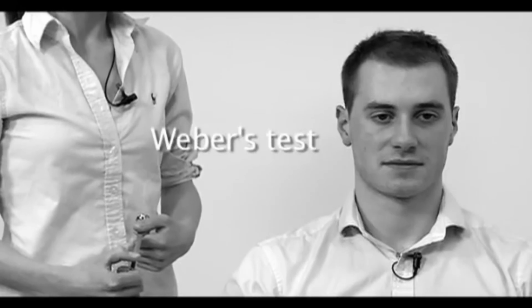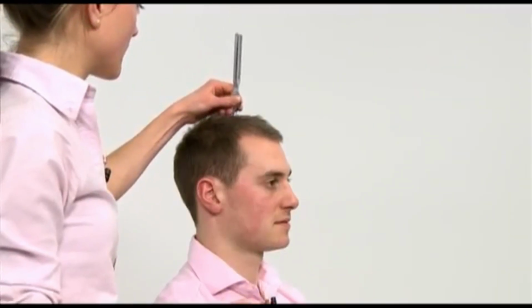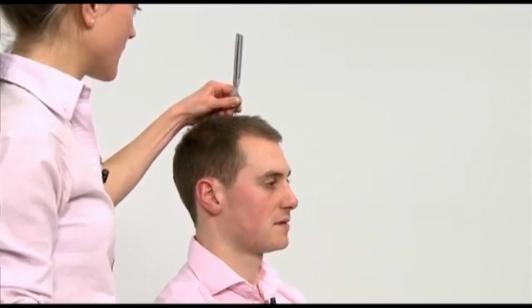Again, it is important to explain the test clearly to the patient. So can you tell me whether you hear the sound loudest in your left ear, your right ear, or whether you can hear it in the middle? Place the base of the tuning fork in the midline. Middle.